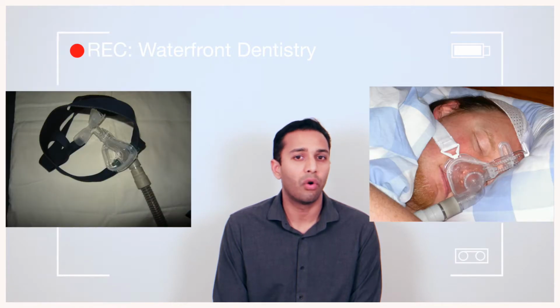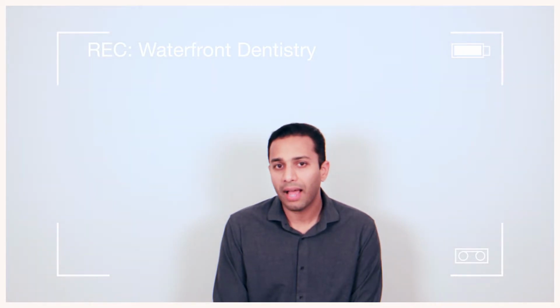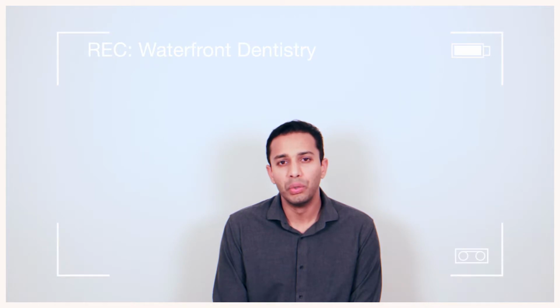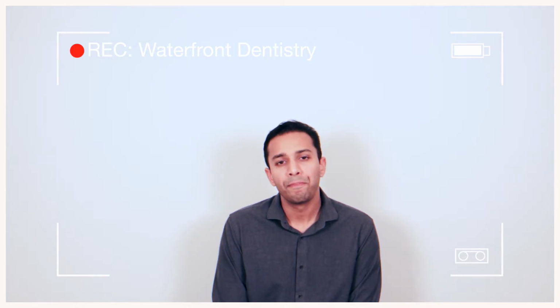Now, this is hugely beneficial for people who are very claustrophobic and who can't wear their CPAP, especially if it's a mild or moderate form of sleep apnea. This is an alternative. Similarly, if you're someone who travels a lot and you are away on business quite a bit, lugging a big CPAP machine might be a little too much, but a snore guard can be easily transported along with your toiletry case, and you can always use it whenever you're out and about. But once you come home, if you really need to, or your doctor has told you that you really need to use a CPAP machine, you can get back to using that.